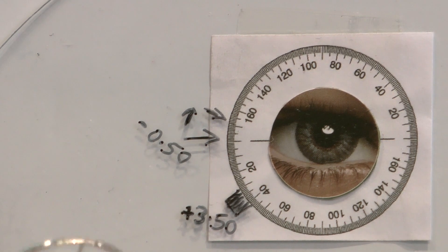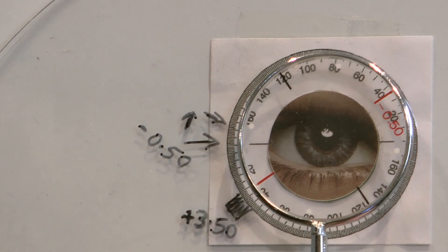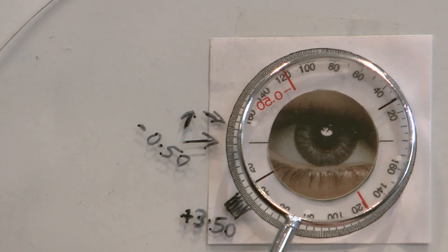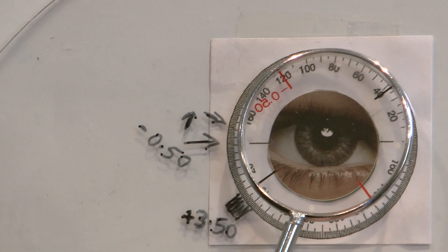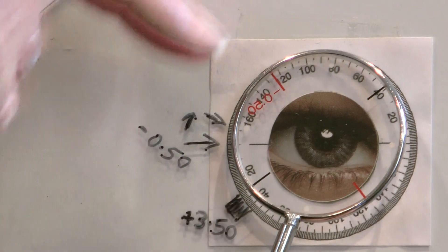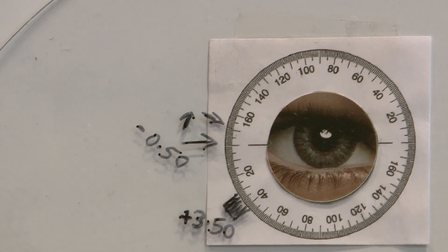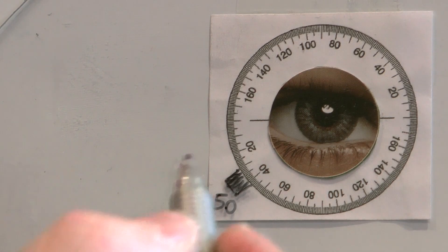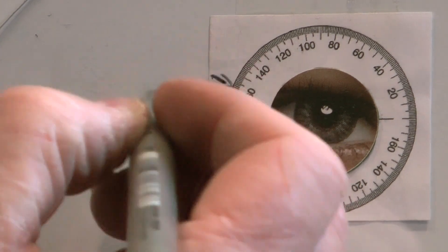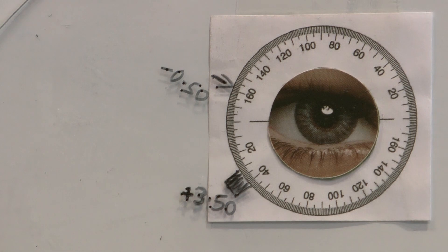We're going to double check that direction using the cross cylinder, using those white dots — this time we put the white dots on 170 and ask: do the circles look more round, darker and sharper in position one or position two? If they prefer position two, we know we need to move the cylinder slightly more in that direction. So we move it another ten degrees to an axis of 160. We've now moved the axis 20 degrees using the cross cylinder method.